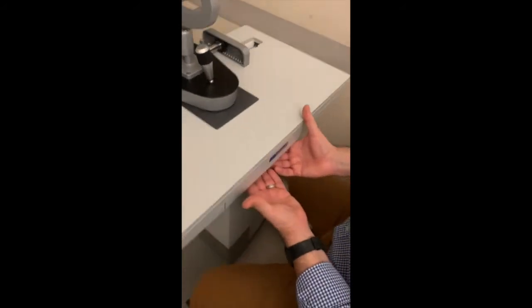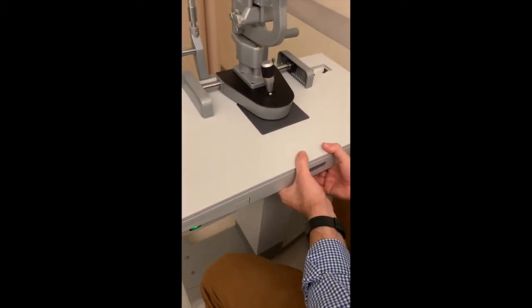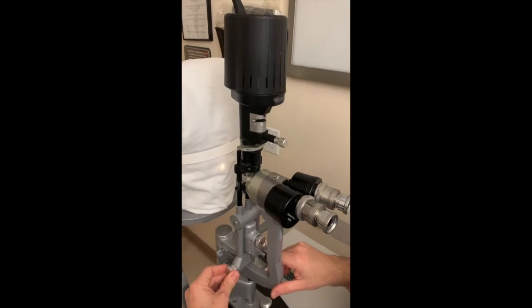There's a release lever under here that allows you to adjust the height of the table. And that's it.